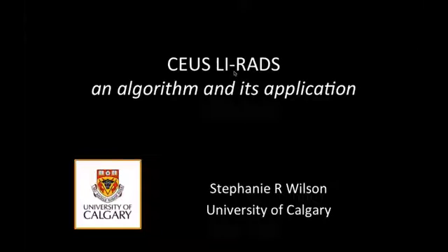First of all, when we apply LIRADS CEUS, we have to be dealing with a patient at risk for hepatocellular carcinoma. We have to start first with a grayscale ultrasound examination and then perform contrast-enhanced ultrasound for characterization of a nodule. To do this, we have to have knowledge of the CEUS LIRADS algorithm, and we have to recognize that the algorithm addresses all of the nodules in an at-risk liver, as was beautifully presented already by Dr. Piscaglia.